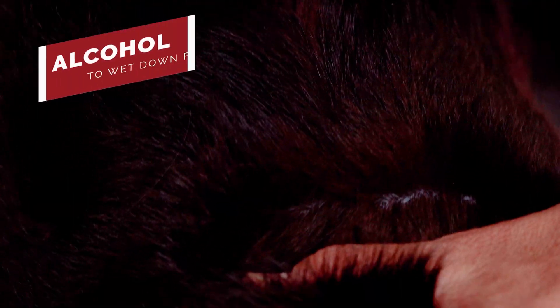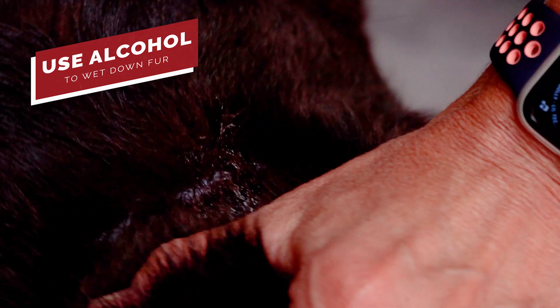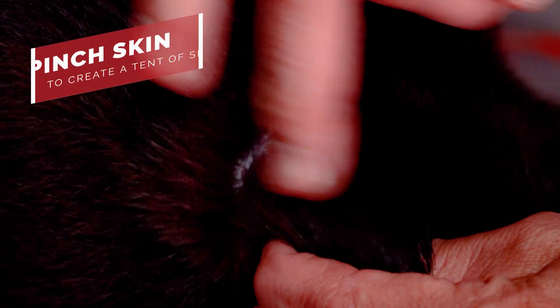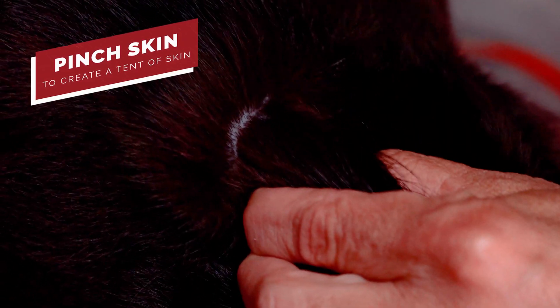Pets really prefer the shoulders or the hips. If your pet has a dense coat, to make it easier for yourself, use a little bit of alcohol to wet down their fur. That way it makes it a little bit easier to see the skin to deliver the medication.